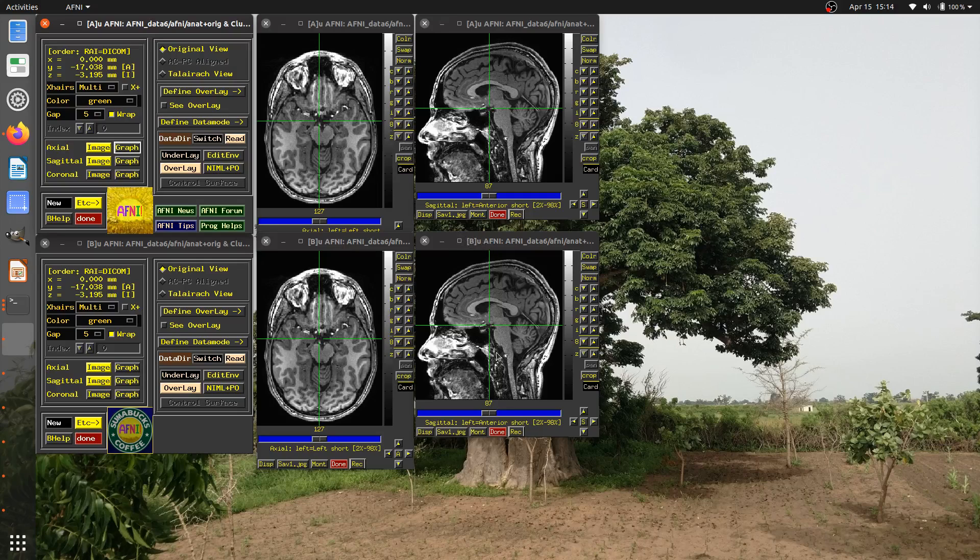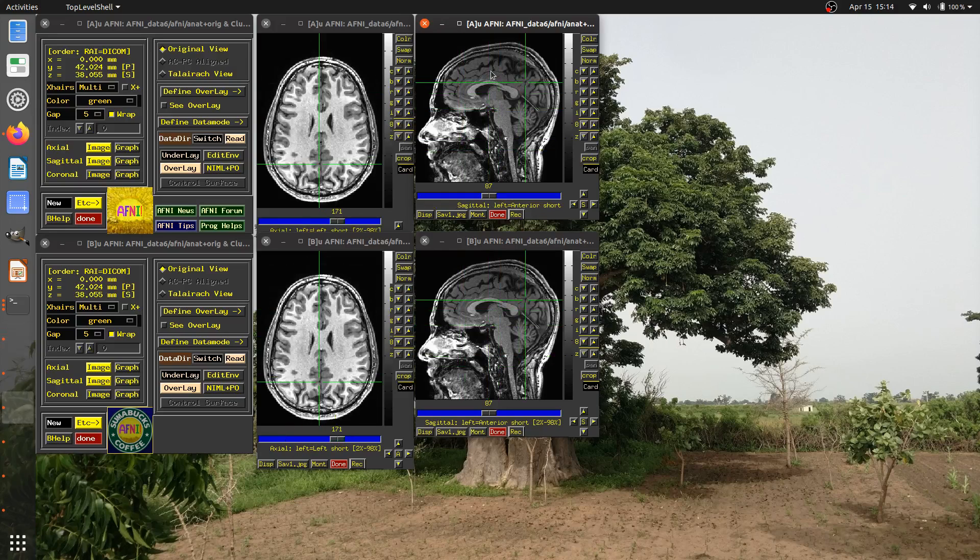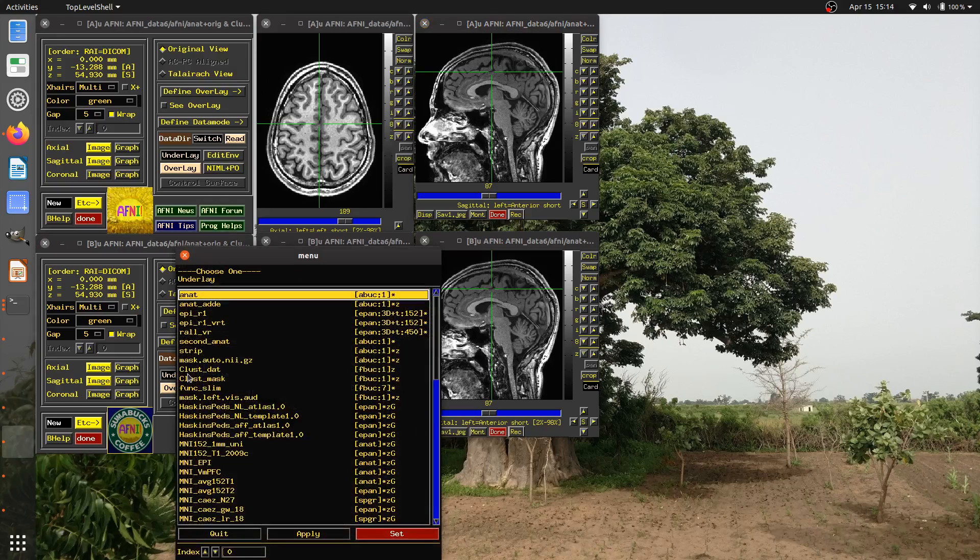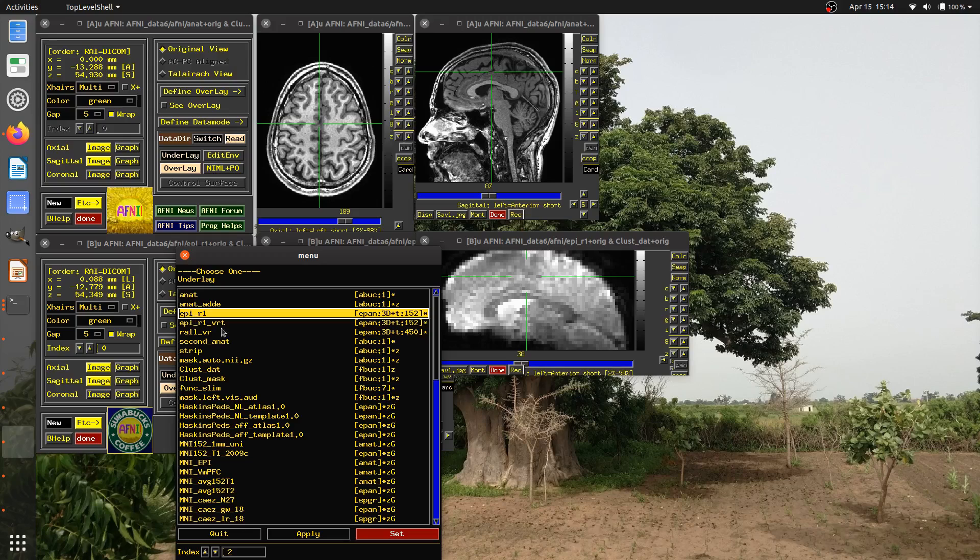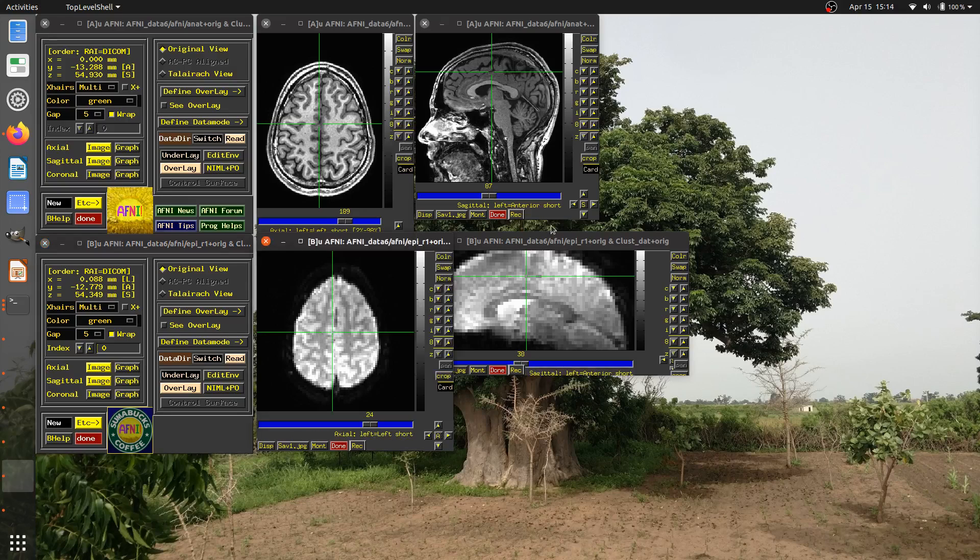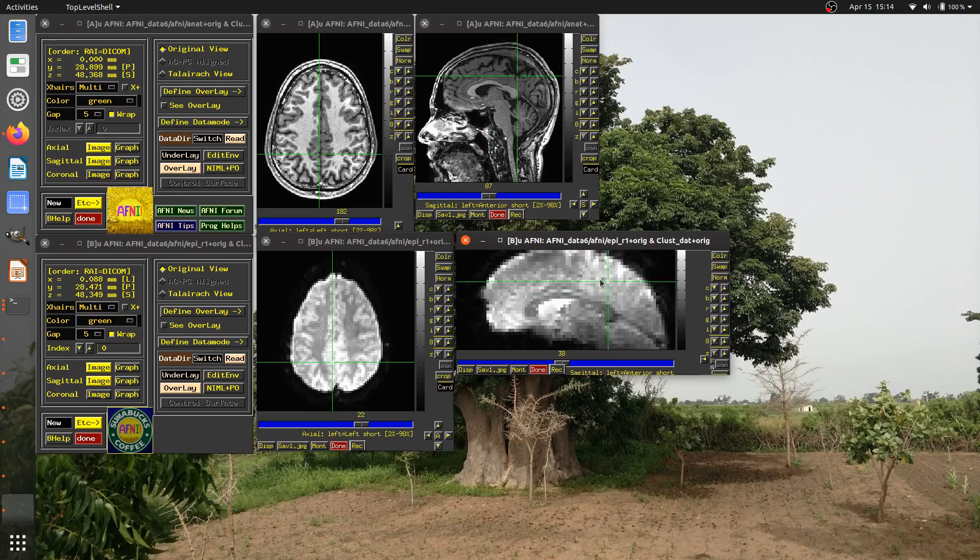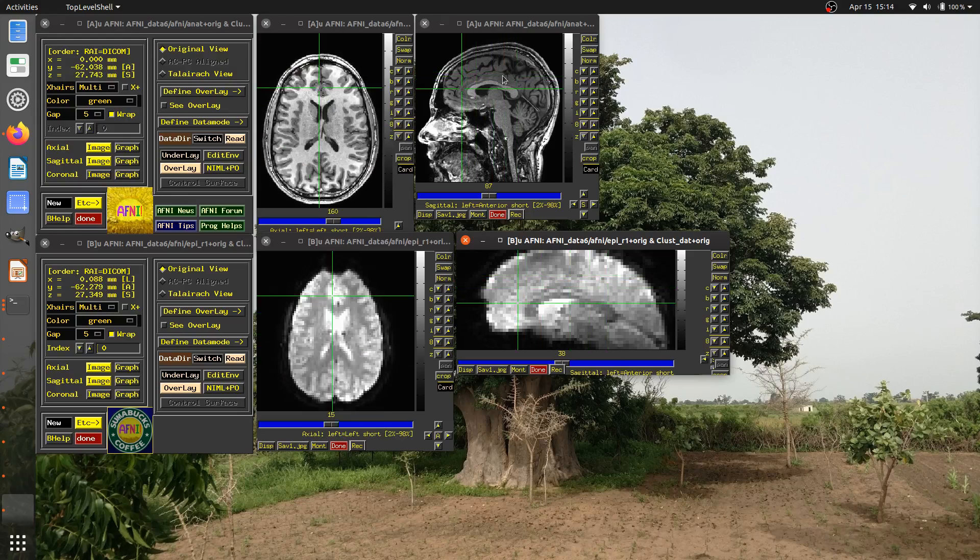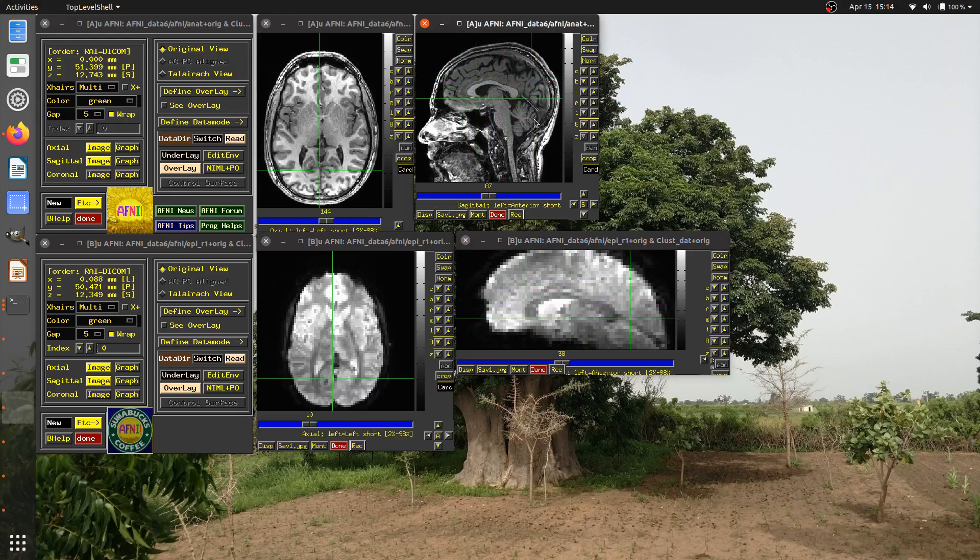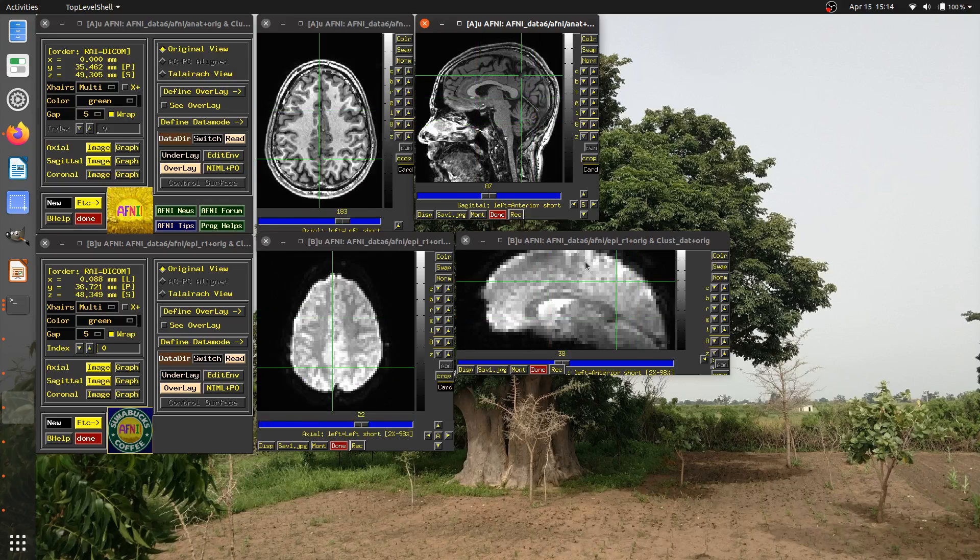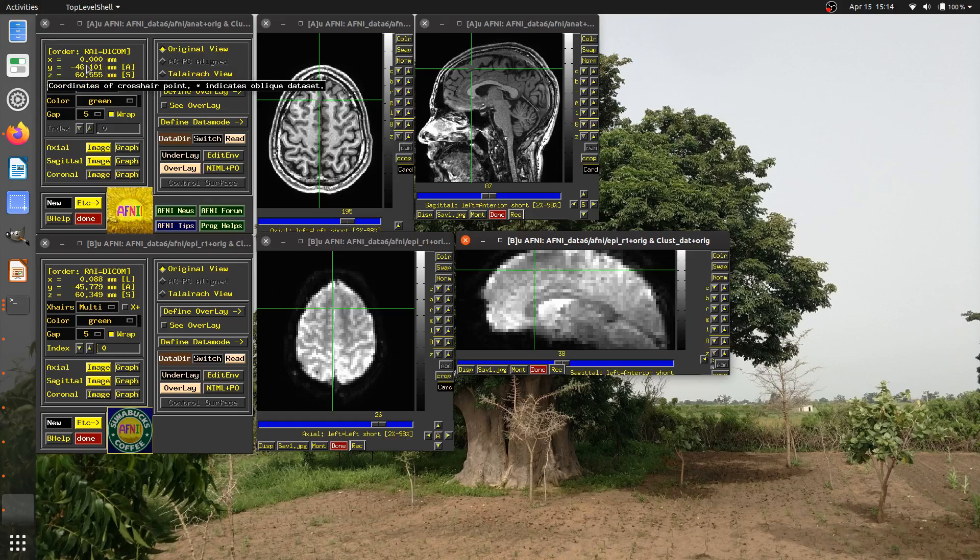We can basically see which control panel goes with which image window here. And right now, I have two of the same dataset. But you see, as I click around somewhere, the coordinates are locked together spatially. If I change my underlay here, right now it's the anatomical by default, I'm going to choose this EPI R1 dataset. And if I click around now, I'll see that the datasets are still locked together.